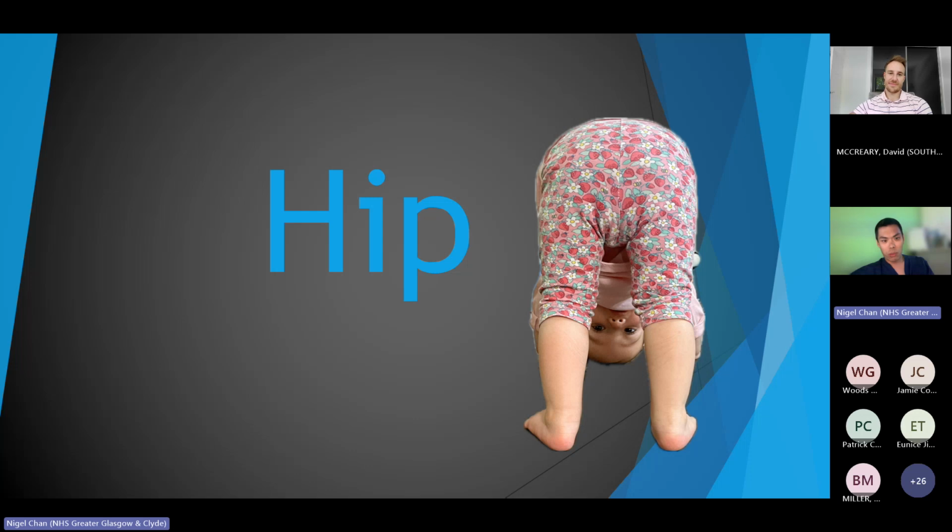So we've got to move on to a different part of the body. Other than the elbow, hips are probably a good place to start if you've not done any scanning. Again, there's a relatively common presentation that we see, kids who come in limping without any trauma. Obviously, the differential for kids who limp is massive. It can be anything from malignancy, infection, nothing, or lots and lots of other things.